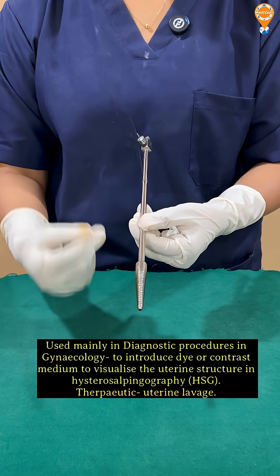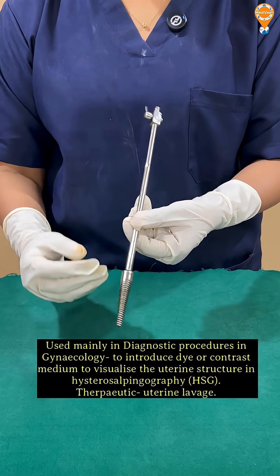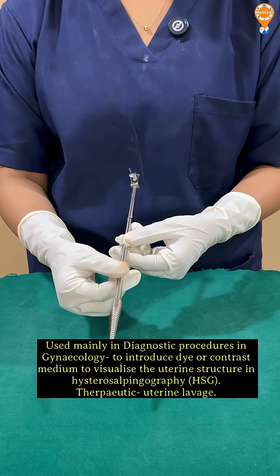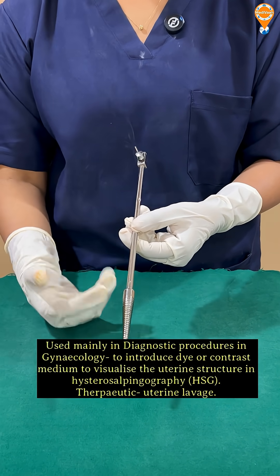We use it during hysterosalpingography to introduce any contrast medium, to introduce methylene blue, or to introduce the dye, or even during uterine lavage to understand any uterine pathology.